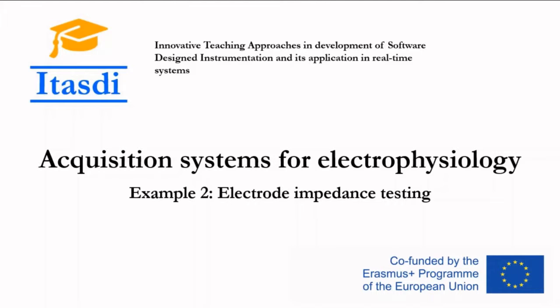My name is Marija Novicic, and in this exercise I'll show you how to make a simple LabVIEW program for measuring impedance of the electrodes.